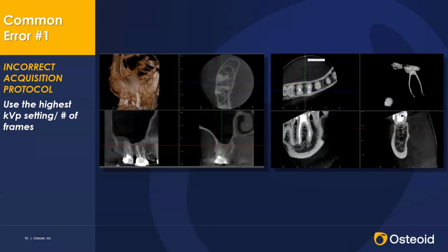although individuals are trying to save patients on dose, they are, particularly in endodontic situations, problematic. So we look at a standard acquisition on the left-hand side here, and the movie shows that we have 2 root canal filled teeth and a missing number 3. If we look at the axial image on the top right-hand side of that first panel, we can see a lot of star artifact or bleeding of the root filling into both the palatal and the buccal area.